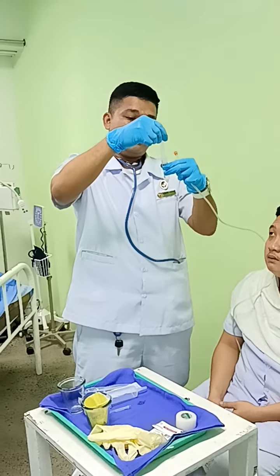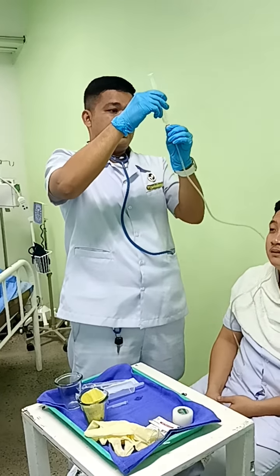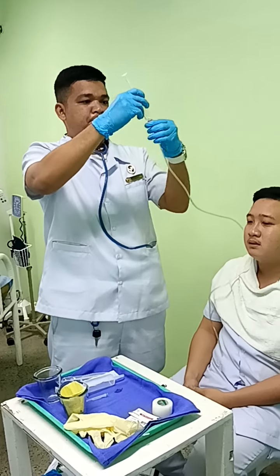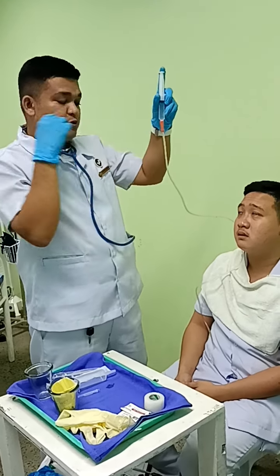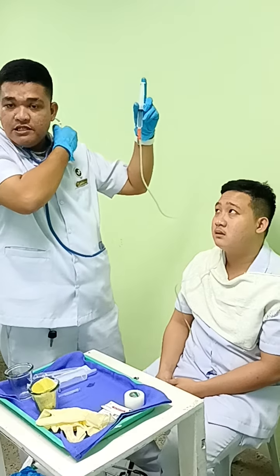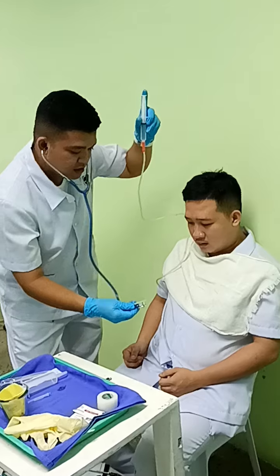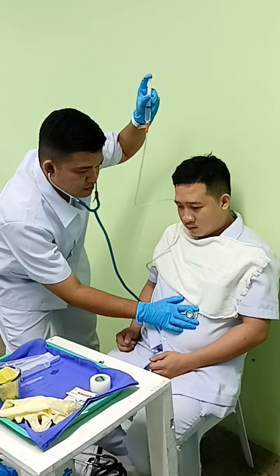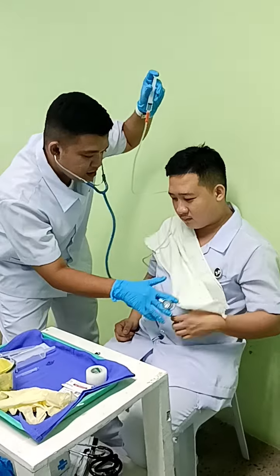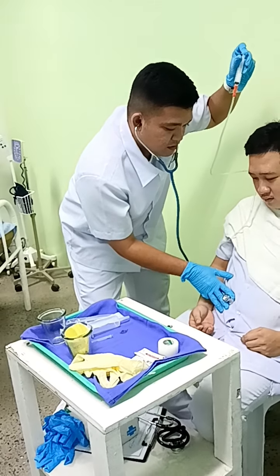Withdraw. Make sure that it's 10 cc. Then we're going to insert, then dispose of the syringe, the materials used, and then we remove the gloves. As we pump the syringe, we have to listen, auscultate. We're going to perform hand washing, and then we document the procedure and reposition the patient as well.